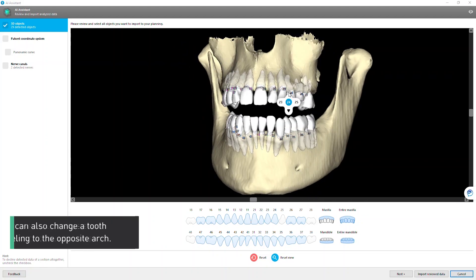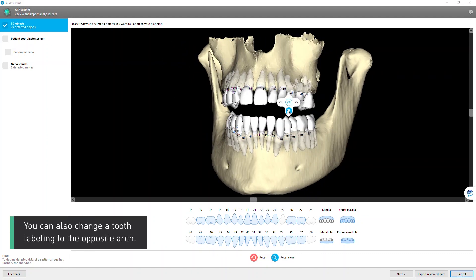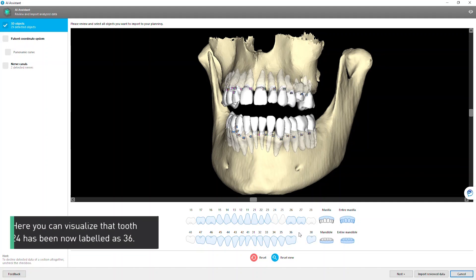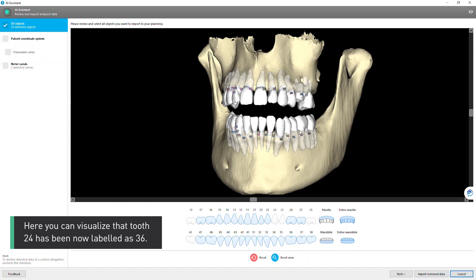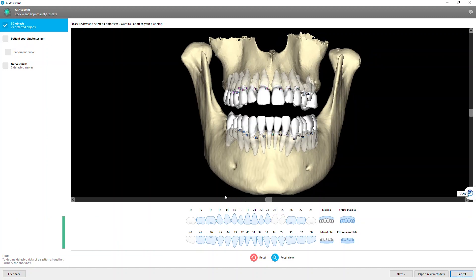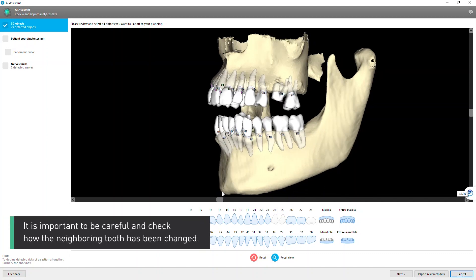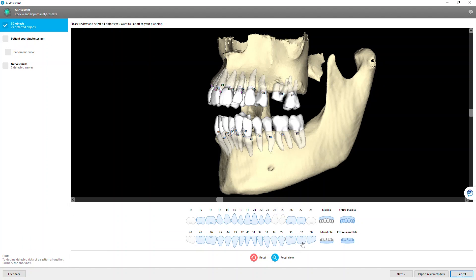You can also change a tooth labeling to the opposite arch. Here you can visualize that tooth 24 has been now labeled as 36. It is important to be careful and check how the neighboring tooth has been changed.